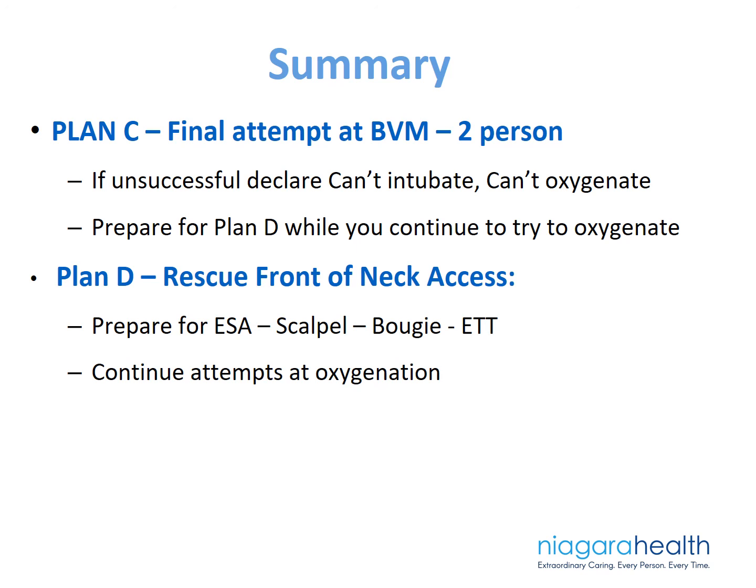Well, I hope that gives you a summary of our pathway, and we will move on to Module 4, where we will go into more detail about our rescue front of neck access and our emergency surgical airway techniques of scalpel bougie endotracheal tube.